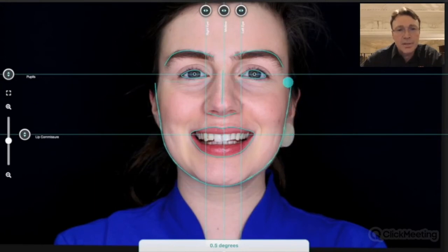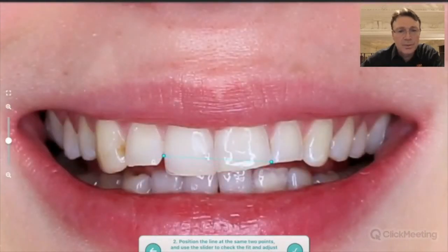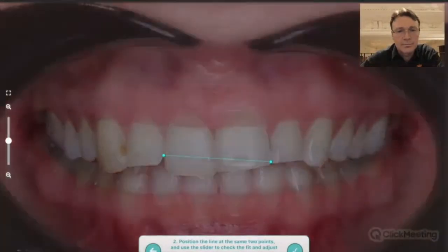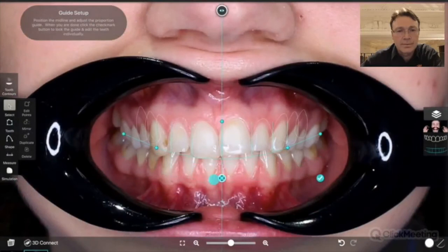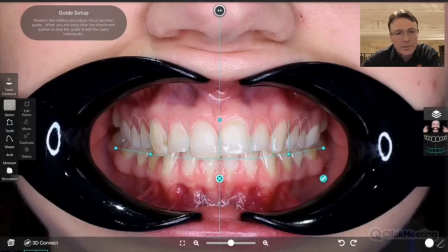The software then analyzes the face, and it does basically all of this automatically. You can alter it a little bit if you want to, if the lines are not completely matching up. And these 2 dots you use for the alignment, or the overlaying, of the 2 photos. You just have to find 2 identical points. You have different libraries that you can use as well.